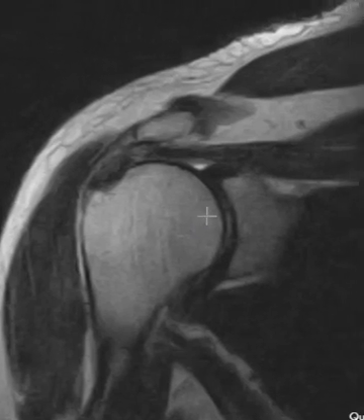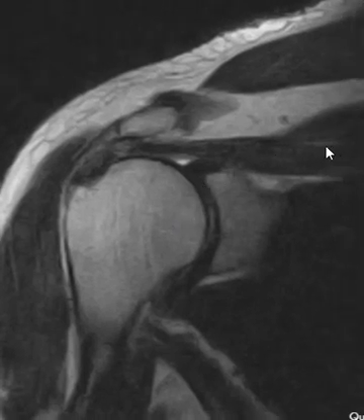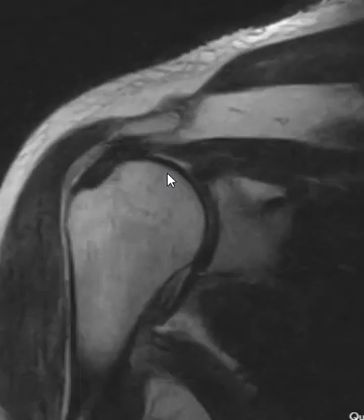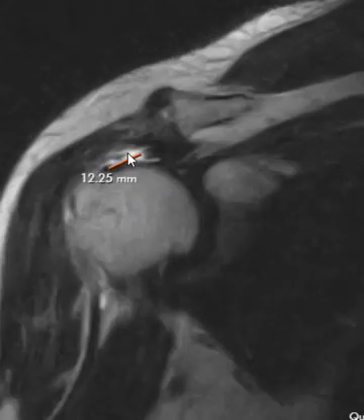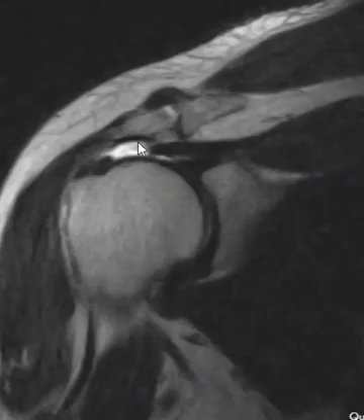This patient has a little bit of motion here, but the rotator cuff comes off sideways from medial to lateral, and the tendon comes down and attaches way over here on this round ball. This is the humeral head, and we can see the rotator cuff should be black, but if we go forward, we see white fluid, and that white fluid is within a hole of the rotator cuff. So it's a full thickness tear of the rotator cuff. You can see that fluid-filled tendon gap right within the tendon. It comes down, ends, fluid gap, and then it attaches over here.